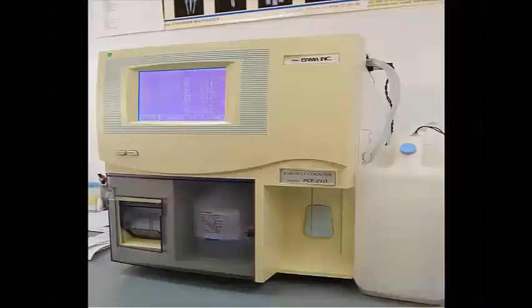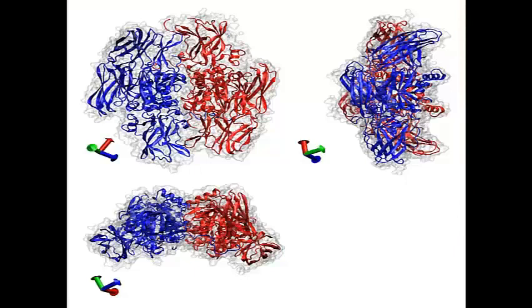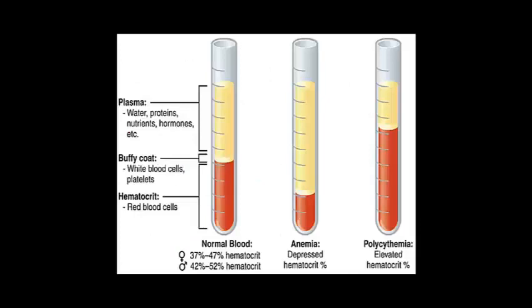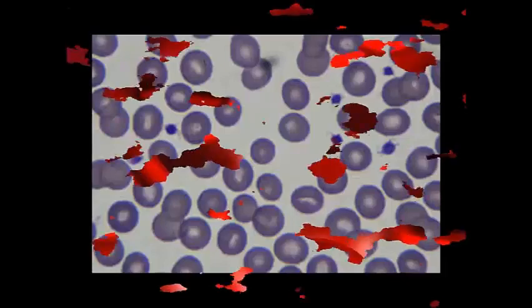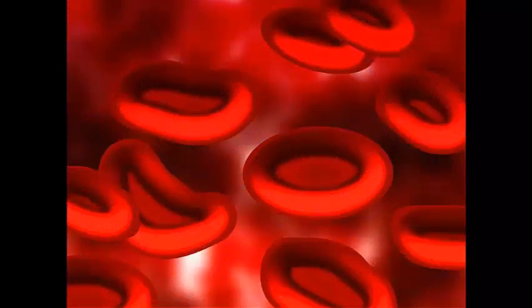Also, some of these devices are capable of measuring hemoglobin, hematocrit, the morphology of red blood cells, and a small number of them are able to do differential counting of white blood cells. The RBC count shows the number of red blood cells in a microliter of blood. Another parameter is HCT, which expresses the volume of blood cells relative to the total blood volume of the sample.